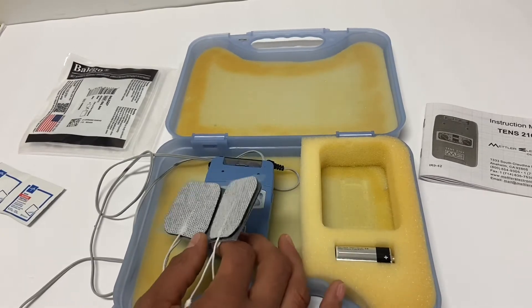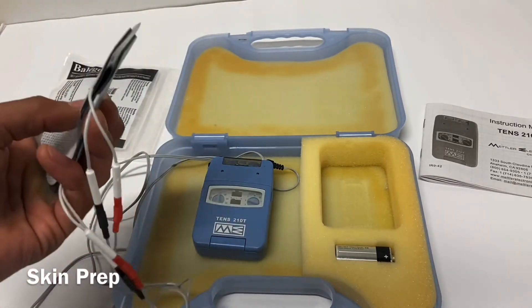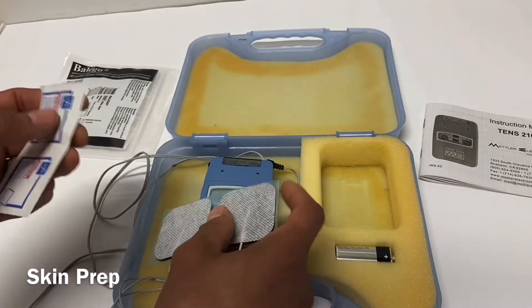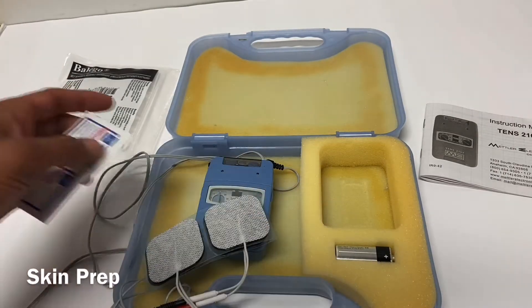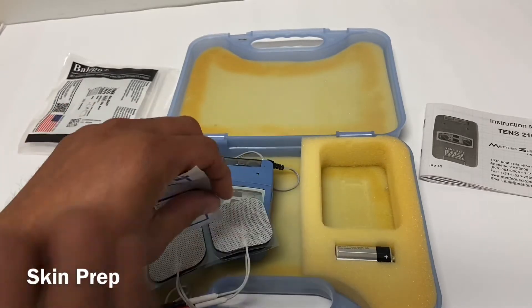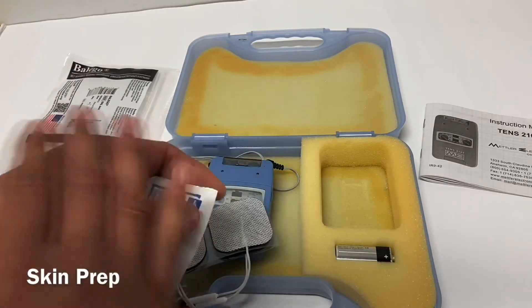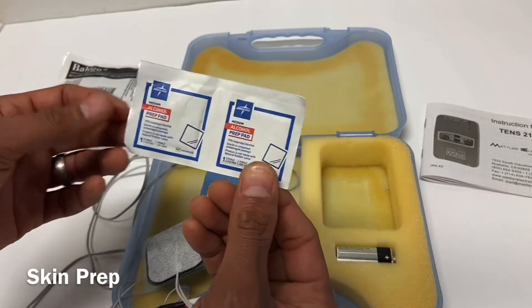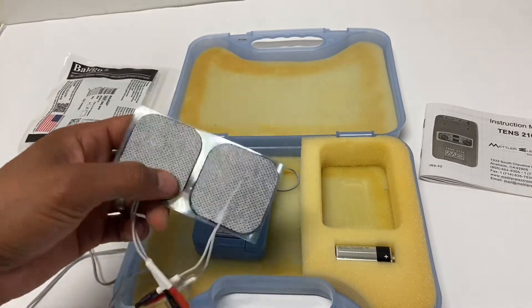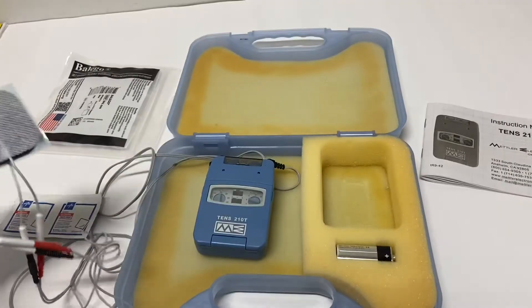We also want to prep the skin. Oils, lotions, or anything like that on the skin will increase impedance and affect the ability to conduct electricity. Mild soap and water works perfectly fine — wipe it down and dry it. You can also use an alcohol wipe or isopropyl alcohol on a towel. Bear in mind that alcohol dries the skin out more than soap and water, which can make the pads a little pinchy. If that's the case, you may need a little aloe vera over the dry skin.